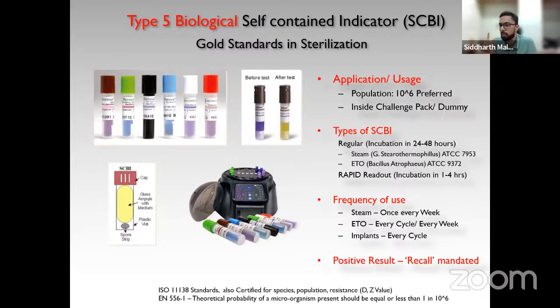The day when you find it positive, out of 6 or 7 different bowls that you have kept, if you find that on the 5th or the 6th day the culture is now positive of the item that you had kept in, minus 1 will be the date which is counted as your expiry time. That is how we scientifically calculate how many days is your expiry time. There are some hospitals who have kept the SMS wrap for 6 months altogether, performed the culture test, and even after 6 months, it was absolutely fine. There was no positive growth.